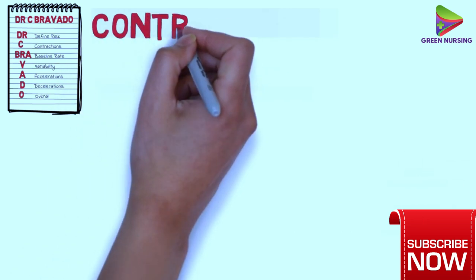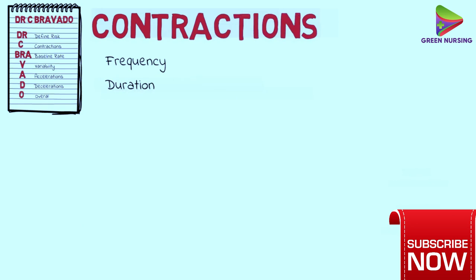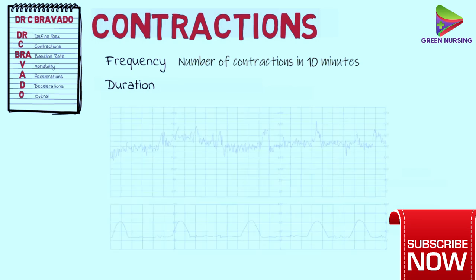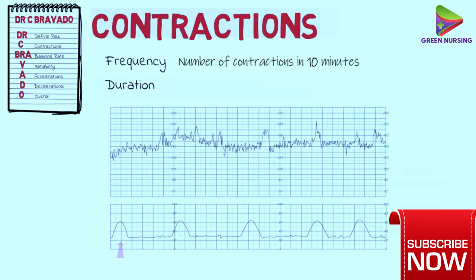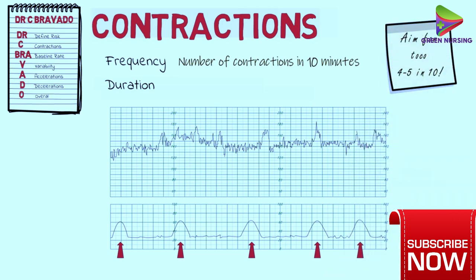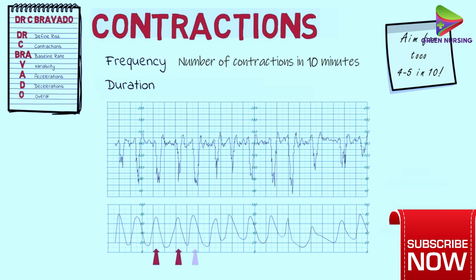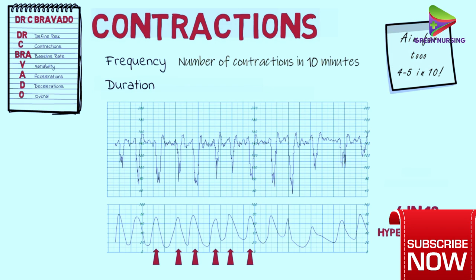Next, contractions. Here we are taking into consideration the frequency and duration of the contractions. The frequency is described as the number of contractions in a ten-minute period. The contractions appear as peaks on tocometry, as we can see over here. In this case, we would say that there are two in ten contractions. It is important to keep in mind that during labor, we should aim to have around four to five contractions in ten minutes. In this next CTG, we can see six contractions in ten minutes — this is called hyper-stimulation, which can result in an abnormal fetal heart trace on the CTG, as in this case.